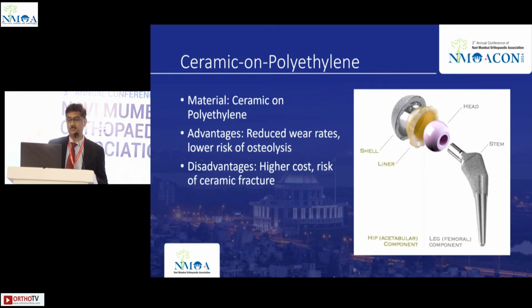So ceramic on poly, this is the most popular. We all use and like it. Ceramic on poly advantages: reduced wear rates and a lower risk of osteolysis. Disadvantages: higher cost, and the risk of ceramic fracture is there.